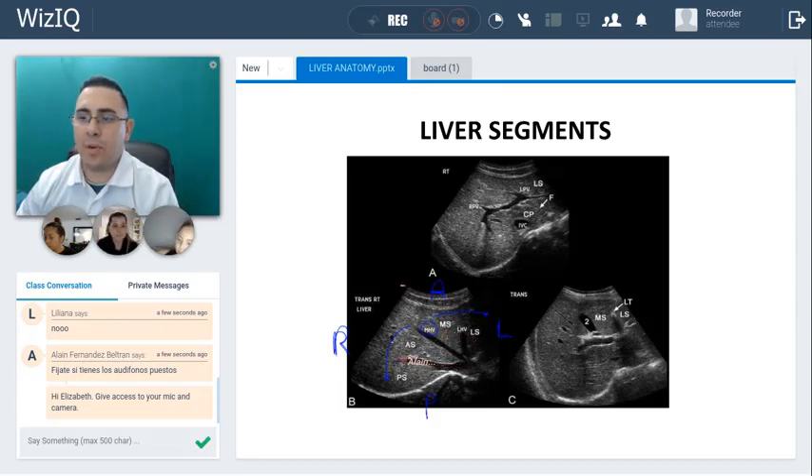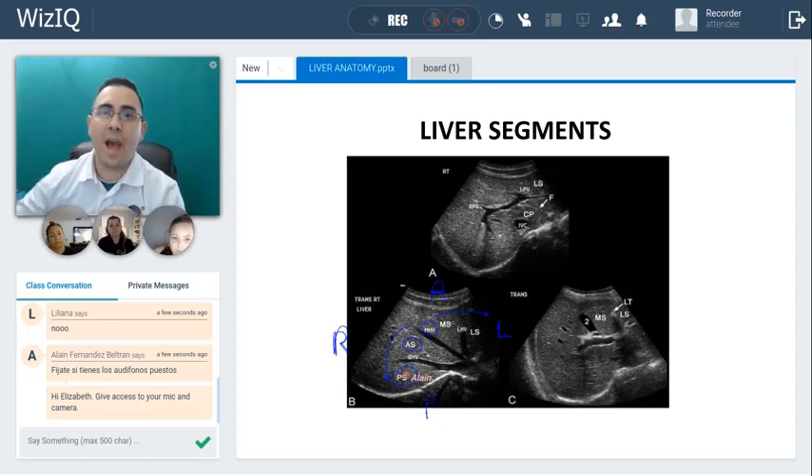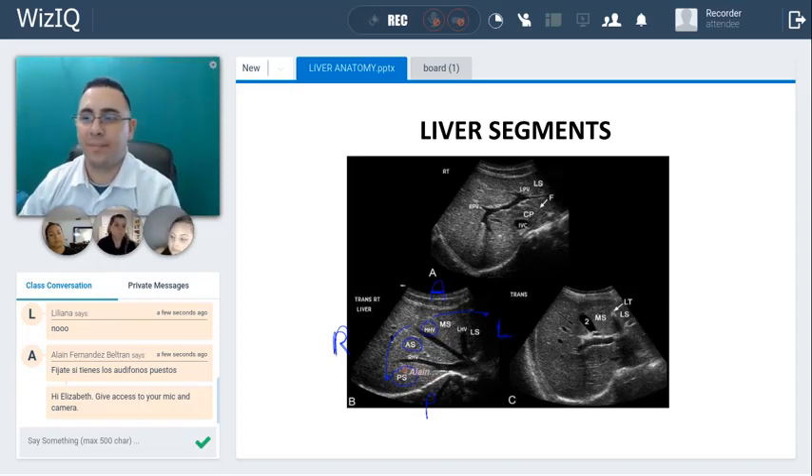Now there's another hepatic vein in here — the right hepatic vein — and this one is going to divide the right lobe of the liver into the anterior segment and the posterior segment. They love to ask hot-spot questions in your test where you have to click over one structure. They can ask you to click over what you think the posterior segment is. The posterior segment has to go posterior to the right hepatic vein, and then the anterior segment is here.